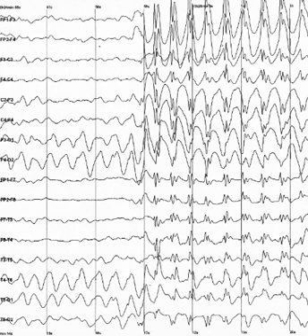Stage 2 sleep is characterized by sleep spindles, transient runs of rhythmic activity in the 12 to 14 Hz range, sometimes referred to as the sigma band, that have a frontal central maximum. Most of the activity in Stage 2 is in the 3 to 6 Hz range.